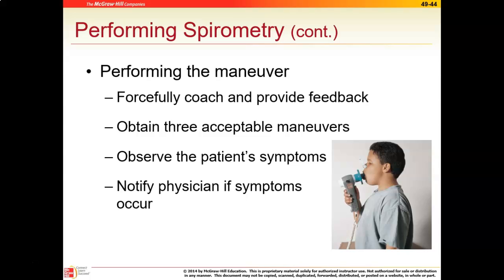You're going to need a big, huge, forcible blow within the first second or two, and then they have to maintain that expiration for 6 seconds, and that can sometimes be difficult to do. Okay, so positioning is important. They should be sitting upright, with the chin up, head kind of forward, nose clip on, and then they need to make sure that they expire out for a full 6 seconds.